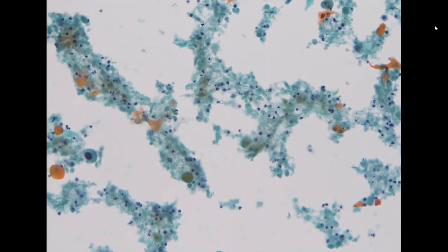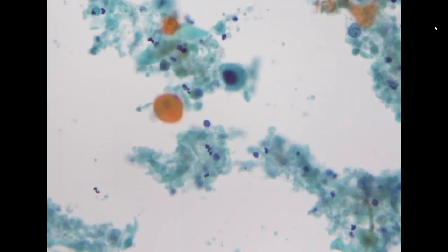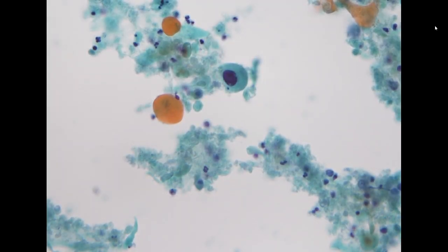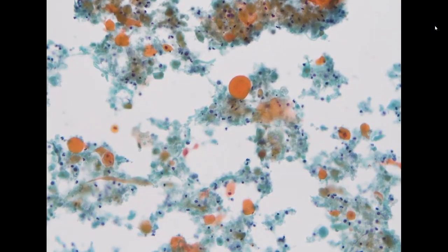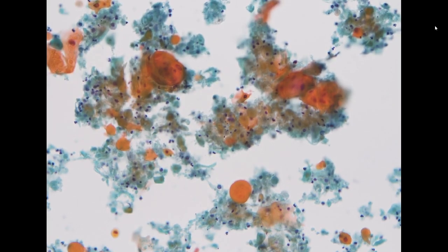In this specimen, we didn't see definite, very high NC ratio immature cells. We only see scattered these types of intermediate cells, but because of the clinical scenario and because of the morphology, it's definitely just necrotic keratin debris, and we will still call this squamous cell carcinoma.